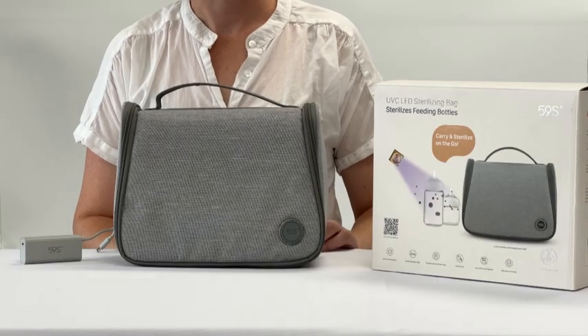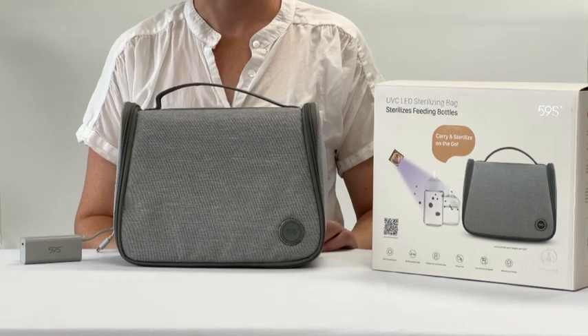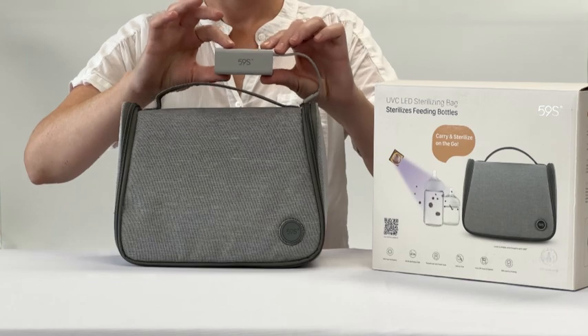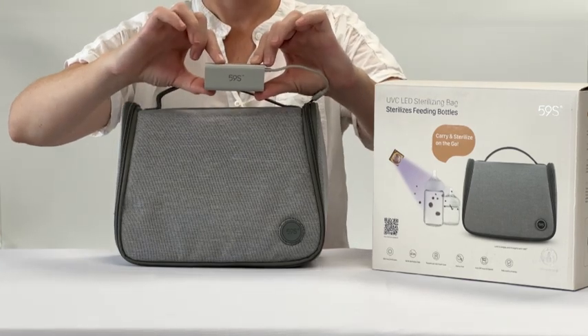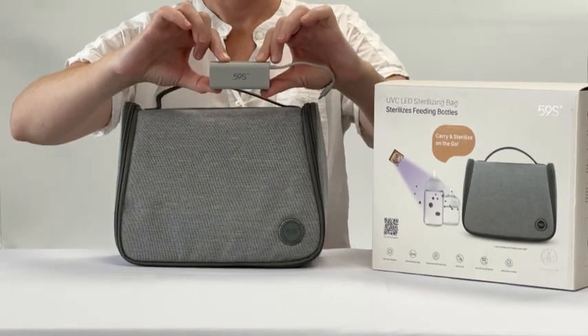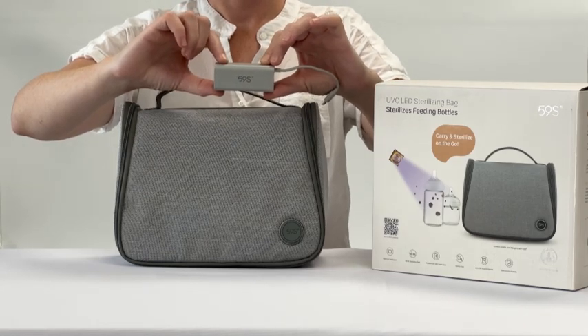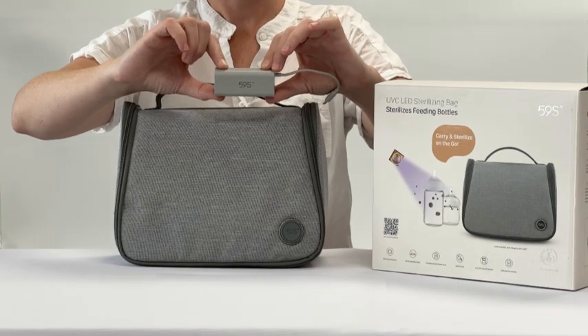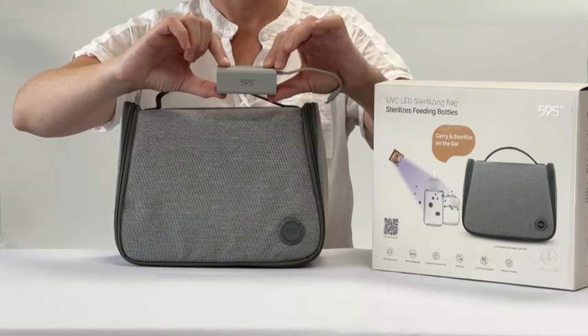How to use your 59S UV sterilizing travel bag. The 59S UV travel bag comes with its own power bank and cord to charge it. We recommend that on first use you charge this power bank for 24 hours. After that, to charge the power bank it should take 2 hours.